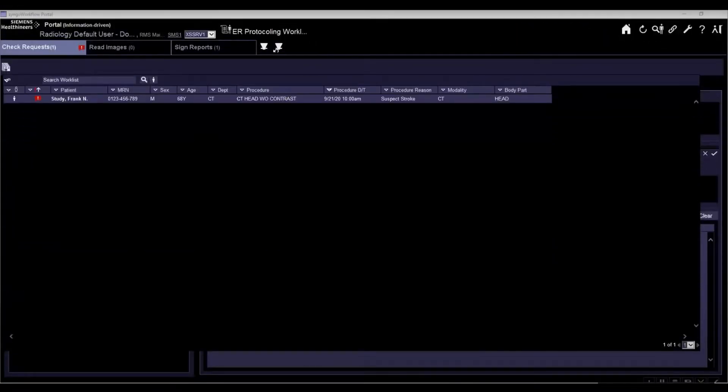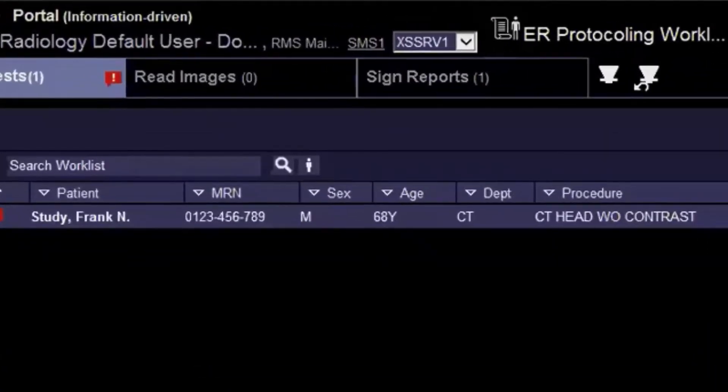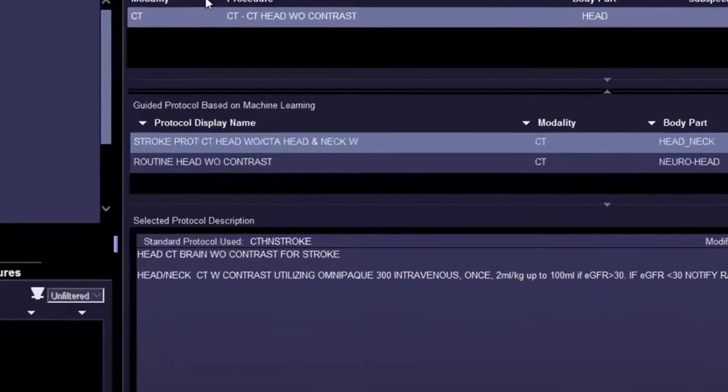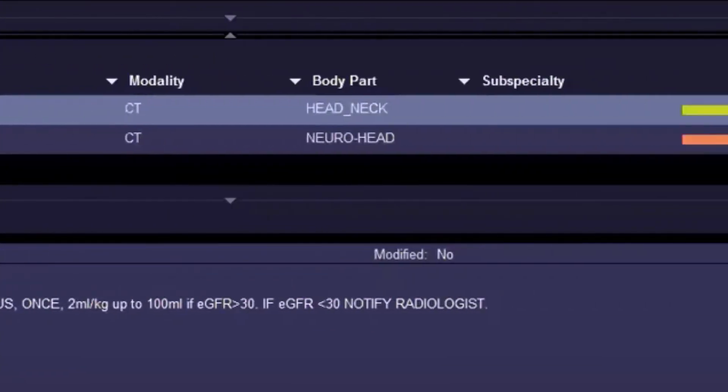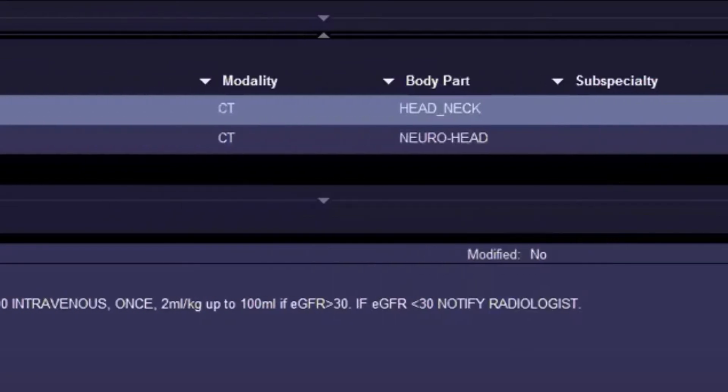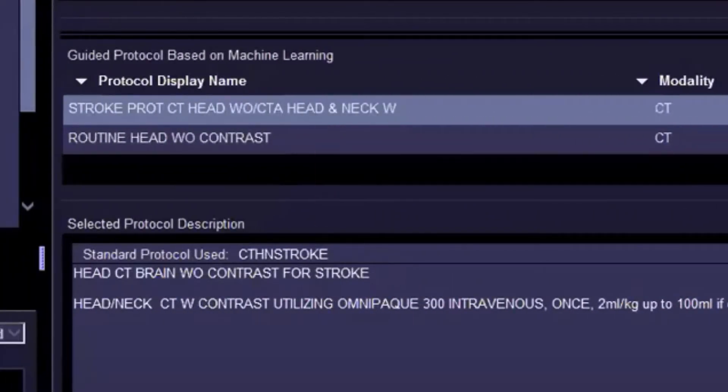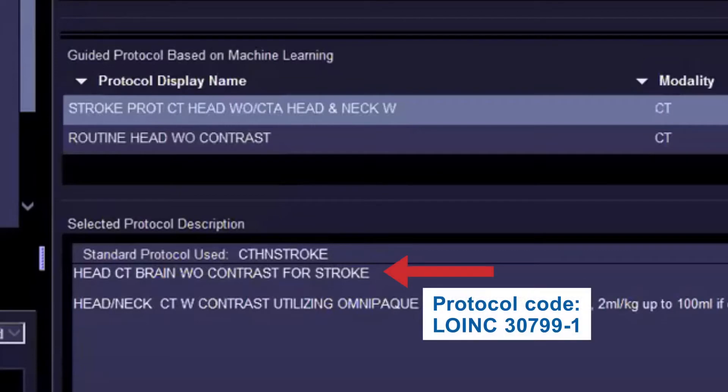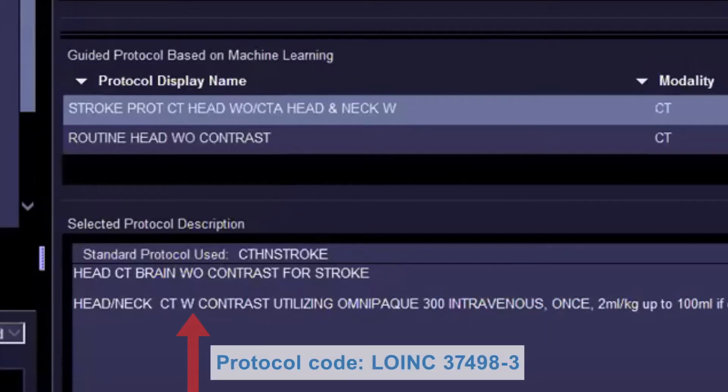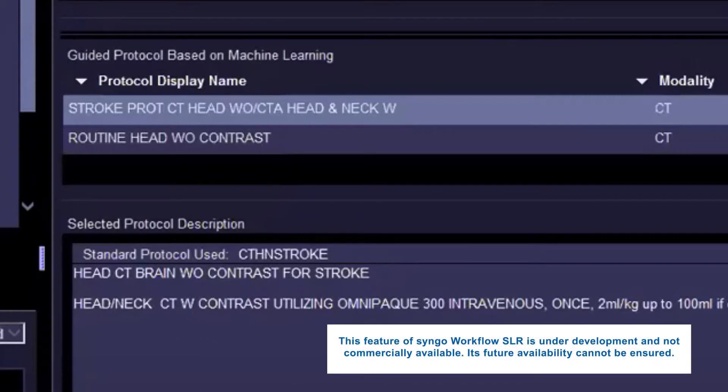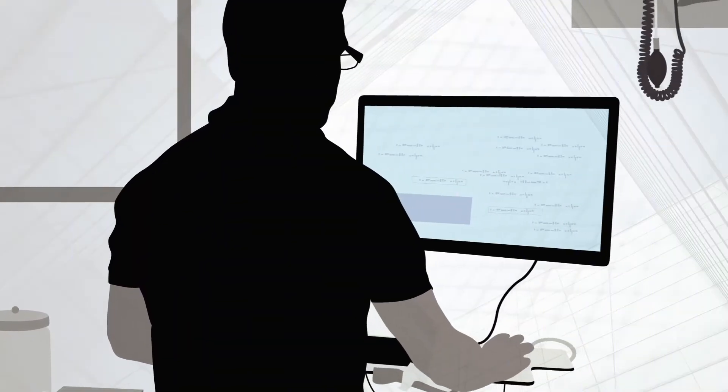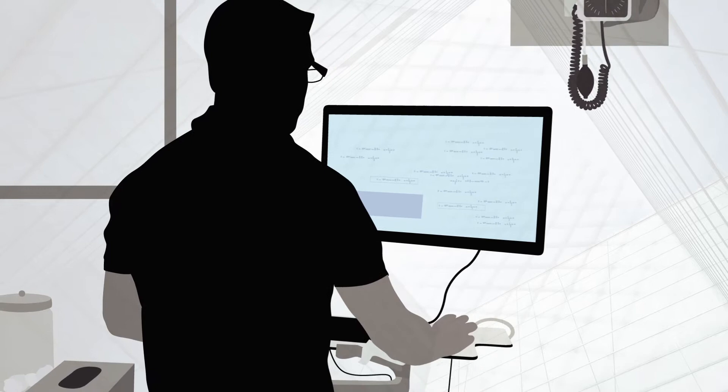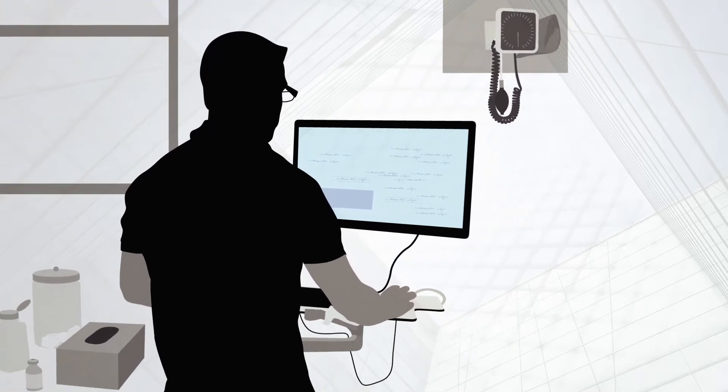In the radiology department, the radiologist sees the incoming order on the Siemens Healthineers SINGO Workflow SLR, which proposes stroke protocol CT head without contrast and CTA head and neck. The radiologist glances at the patient chart and quickly and easily selects the accept button, passing the protocoled exam information to the technologist, saving critical time over the course of the radiologist's day. Note that the protocoling radiologist always has the ability to override the AI's primary choice. The patient is transported to the CT scanner. The technologist sees the AI refined protocol.